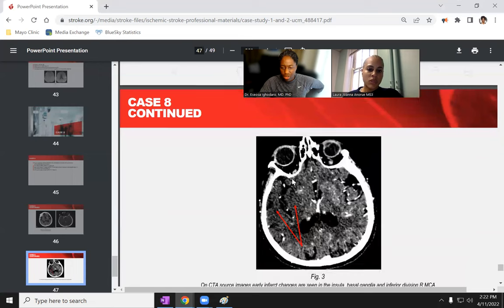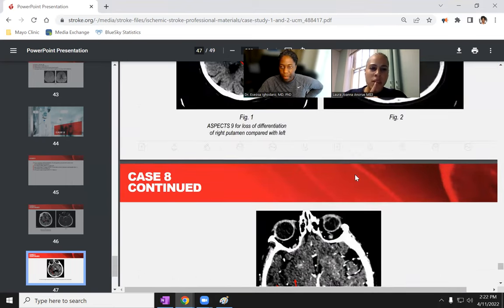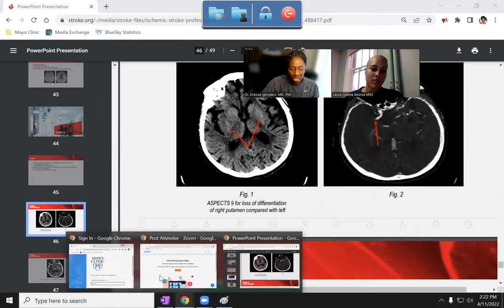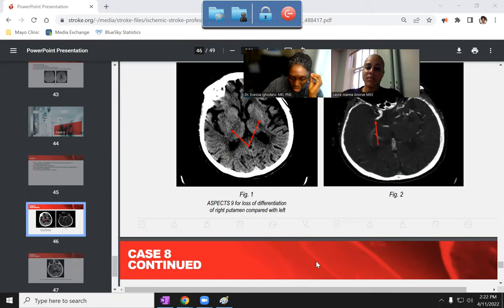I didn't know you could calculate the ASPECTS off of CTA, but I've never seen that done before. So question then, the lenticulostriate arteries, those feed that basal ganglia, they come right off of that M1, right? Yes. Oh, yeah. Well, then that makes sense. I just had an aha moment. Let me pull up that image again, because for me things click when I see it. So let me just pull it up again.